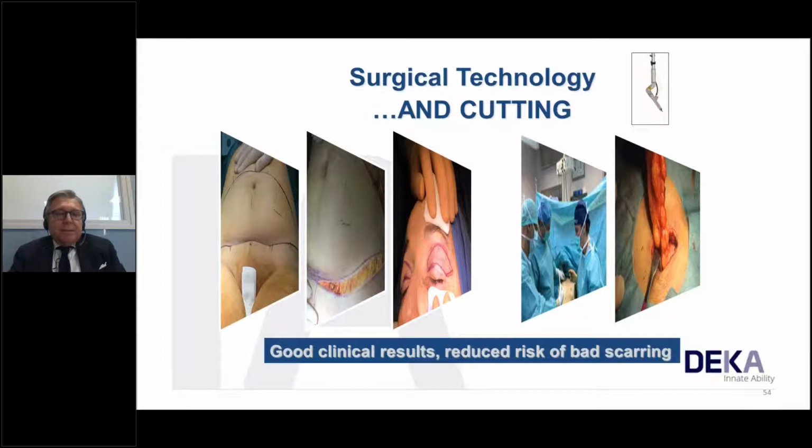indications and cutaneous conditions. On the left, you see from the abdominoplasty through the blepharoplasty, until the breast augmentation by cutting the periareolar area, and then just the treatment of the lipoma.